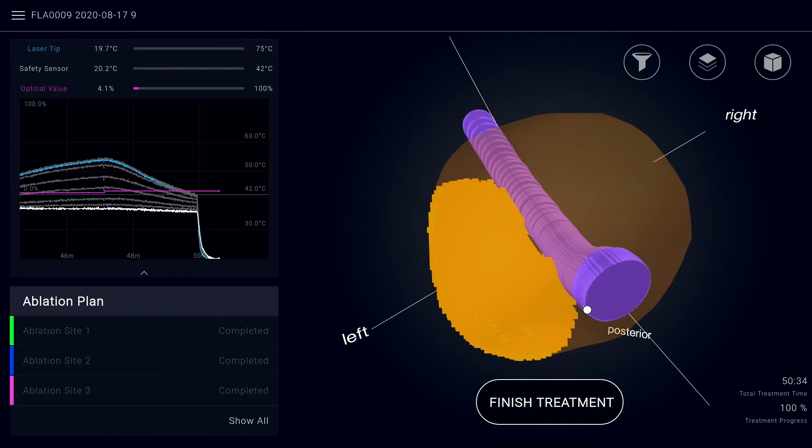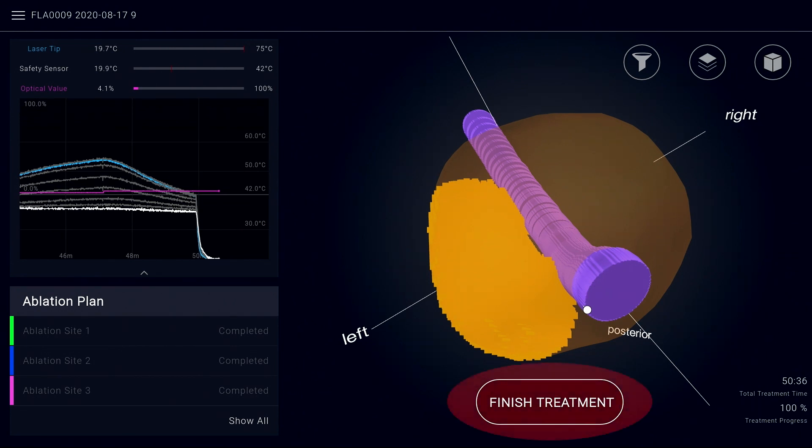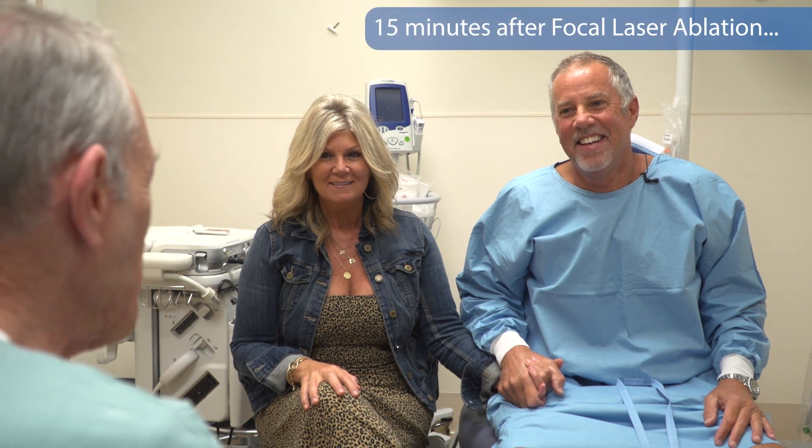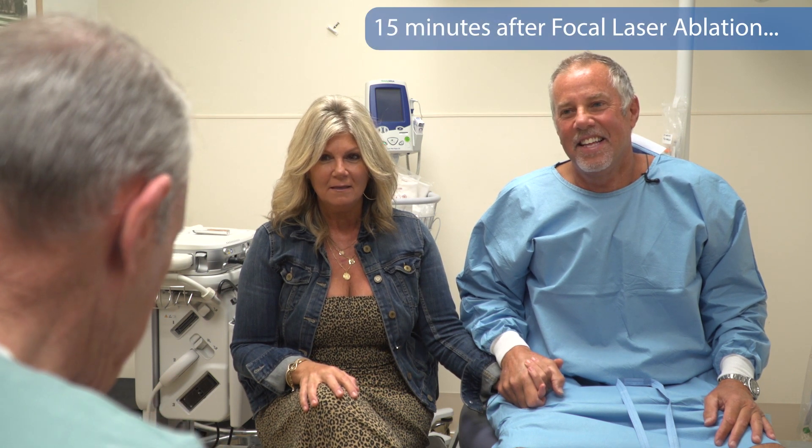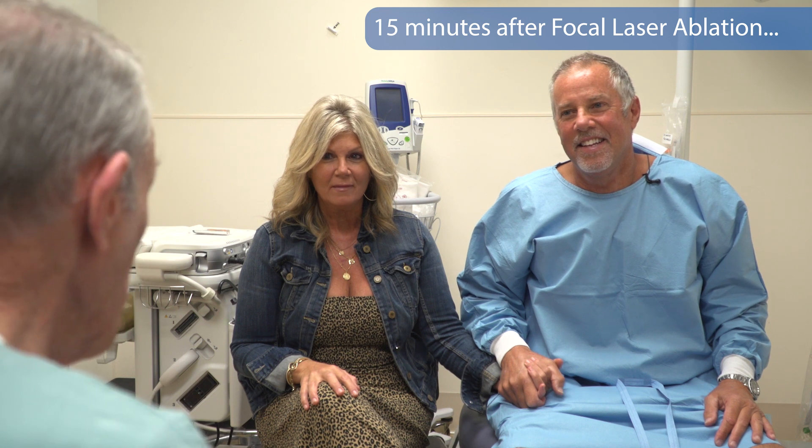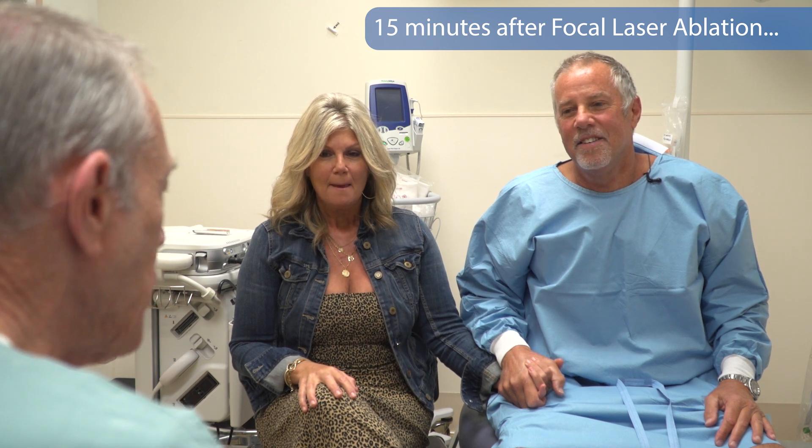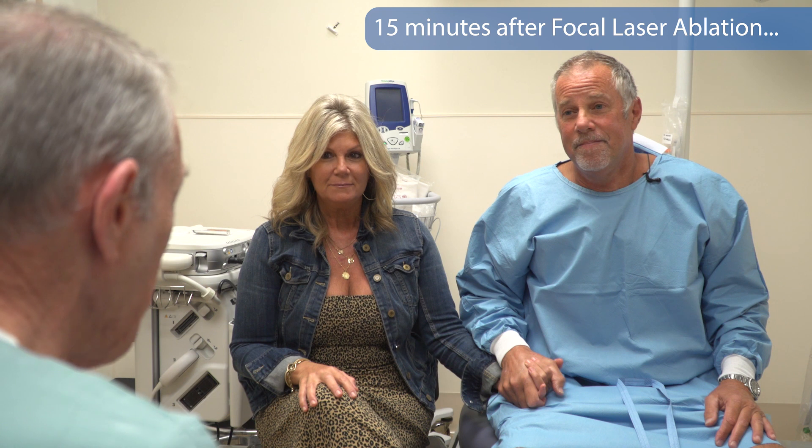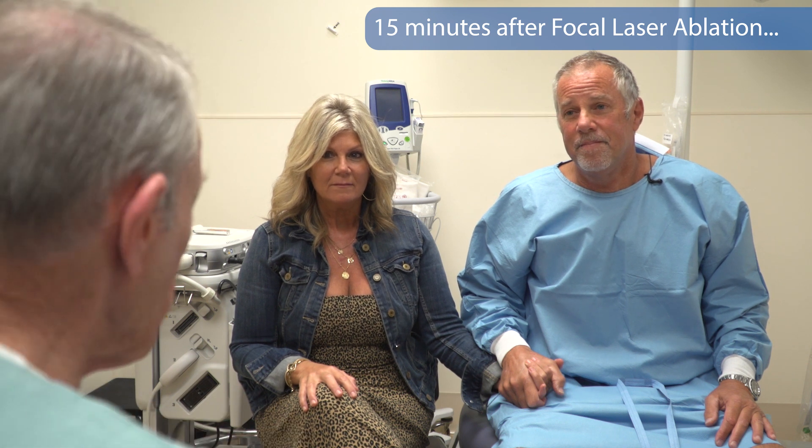Once all ablation sites have been treated, press the finish treatment button. Brian, we're all finished. My watch says 8:55, an hour and 10 minutes since we brought you into the room. We're done. It was a nice successful ablation. Describe the procedure for us.